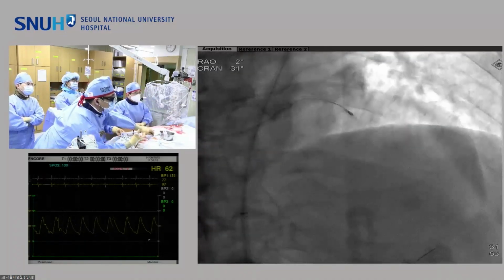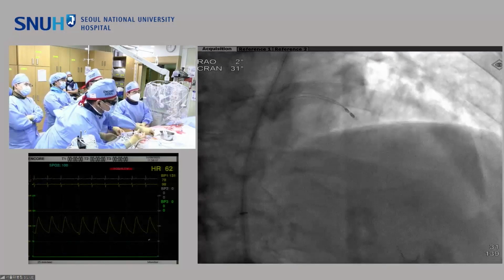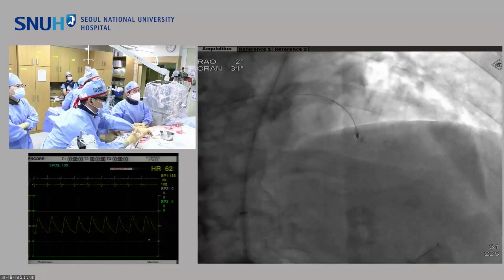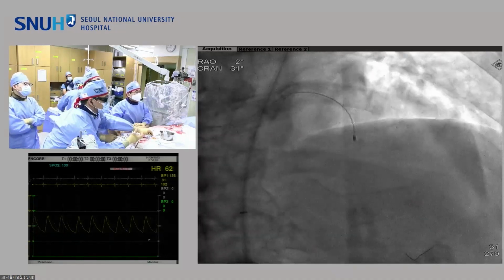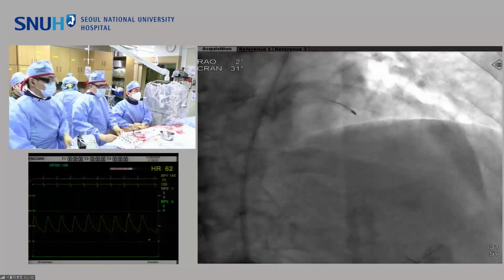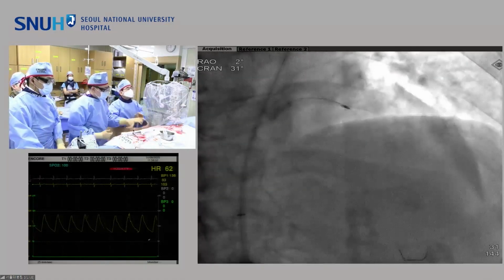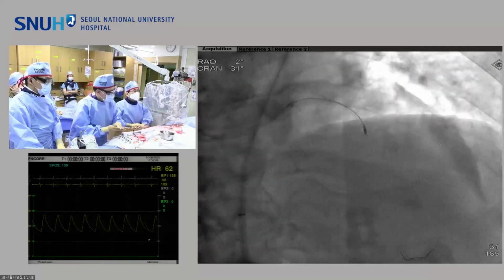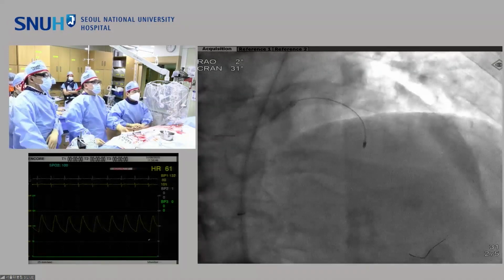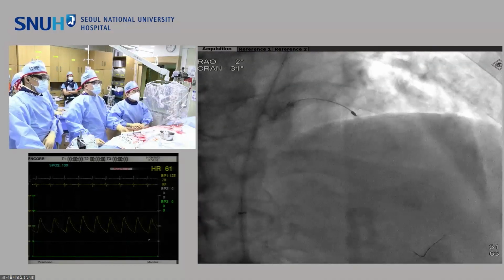Yeah, the burr passed at 190,000 RPM. Very nice. Then I tried to repeat once again to polish the lesion, and then I tried to reduce RPM down to 160, 150 to expect a slight orbital motion of burr to make a greater debulk. So I always try to use the burr like this pattern of practice.